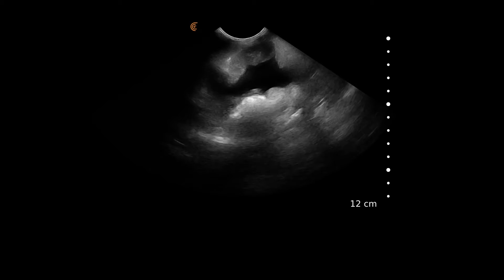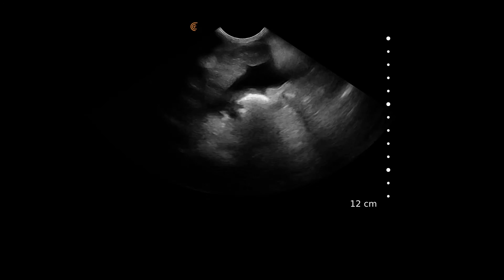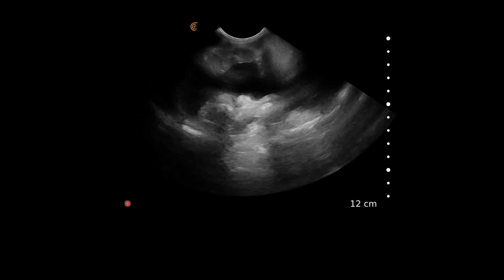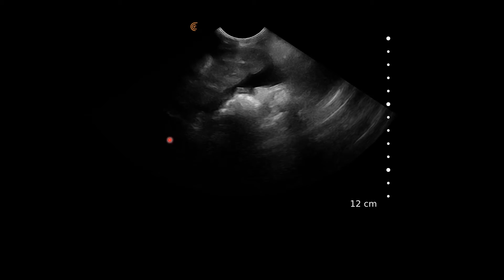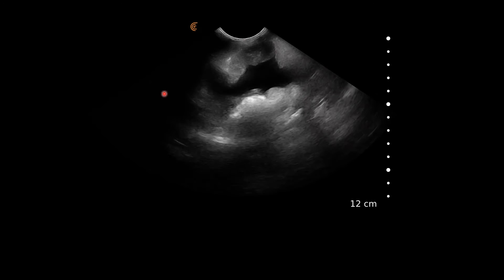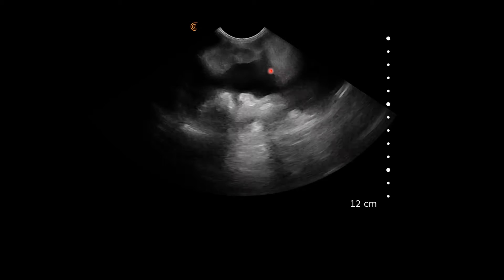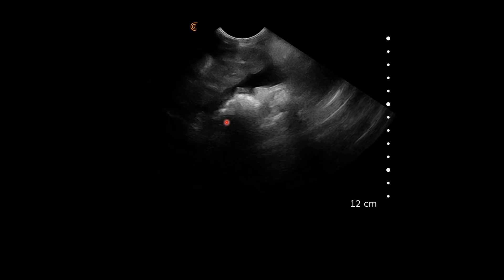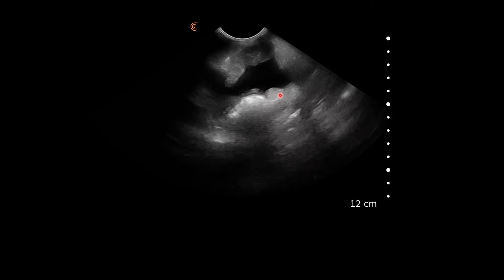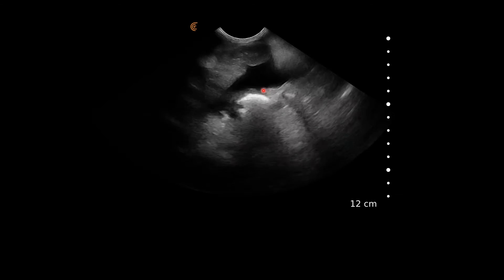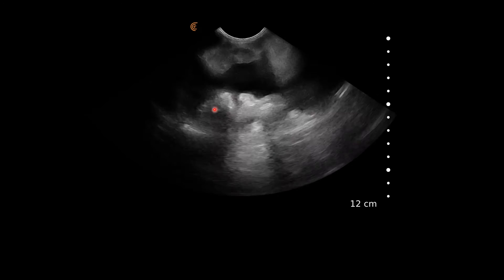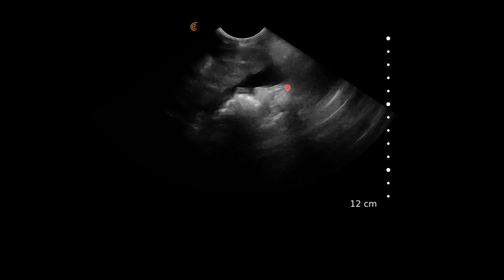In this recording, we can see the cranial part of the abdomen. We have the liver over here, and we can see an enormous amount of free fluid. In this abdomen, we have some gastrointestinal tract and all this anechoic area is free fluid.